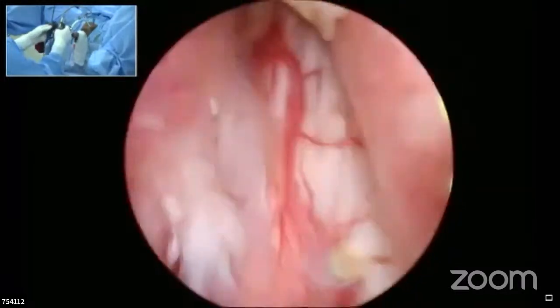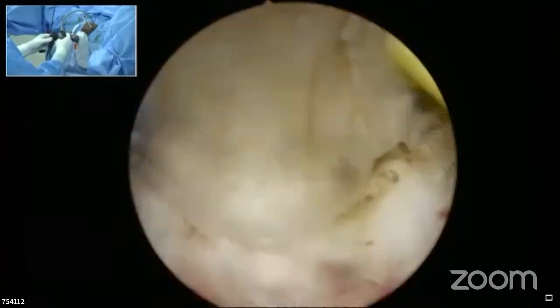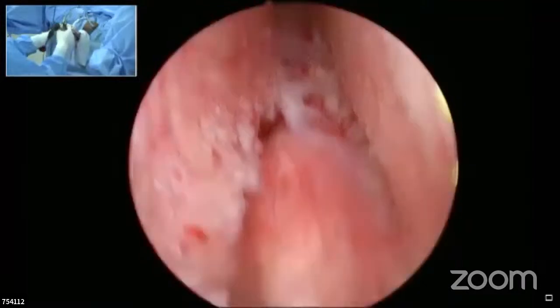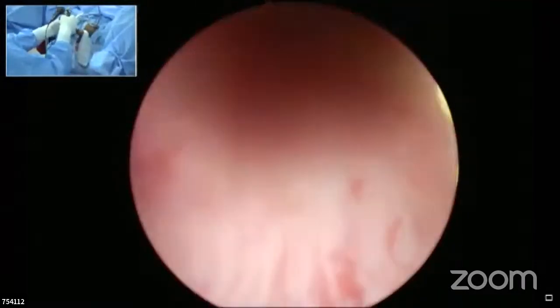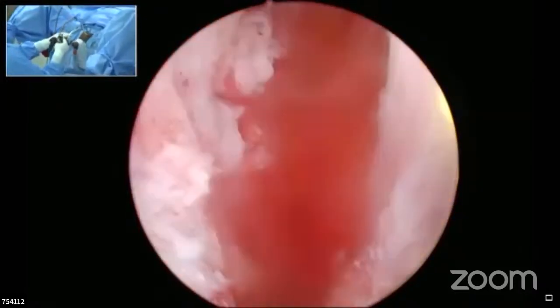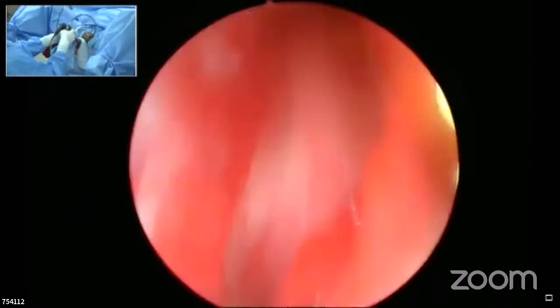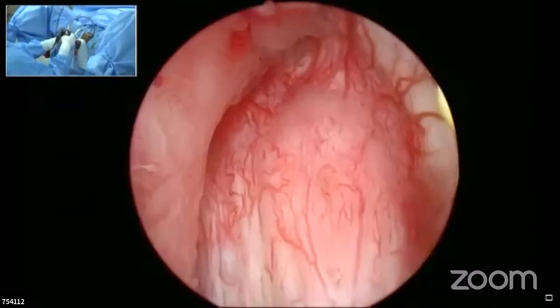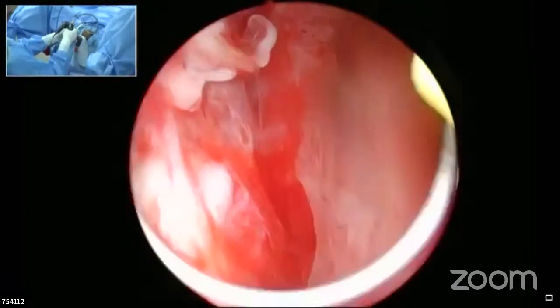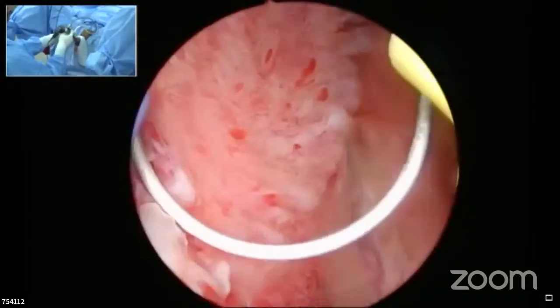So at this point, I would proceed to approach the lateral lobes and come back to this tissue which is left behind along with the remainder of your lateral lobes. So we come back. The main landmark again is the zone of contraction of the sphincter and the length of the sphincter that you would want to leave. The classic landmark would be our verumontanum, but here we have sufficient amount of overhanging tissue. So we would need to debulk the gland adenoma here.